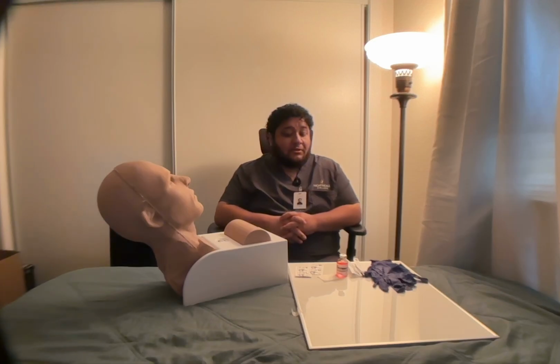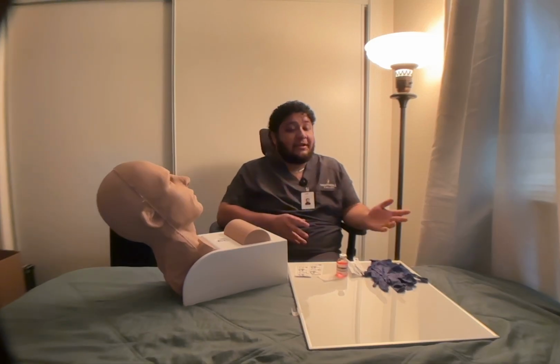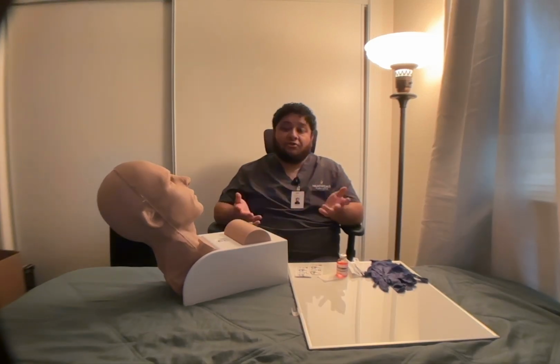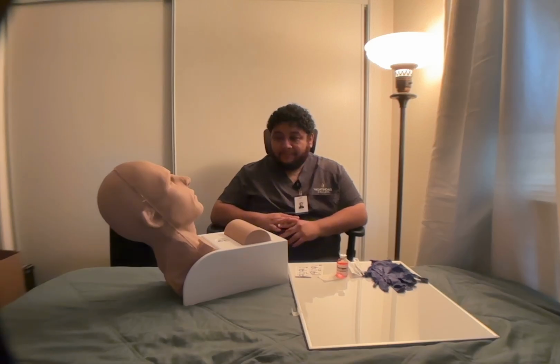Okay, so I will gather my supplies, enter my patient's room, close the door behind me to ensure patient privacy, and I'm gonna lay down my supplies on the clean flat surface, and then I will go ahead and perform hand hygiene and introduce myself to my patient. Hello, my name is Christopher, and today I'm going to be your nurse.